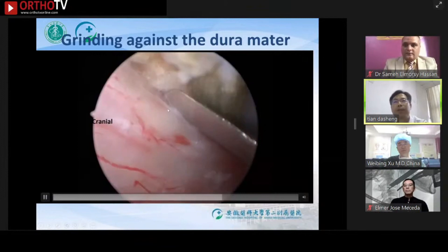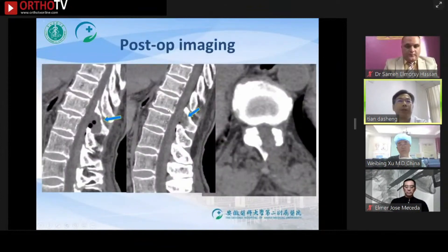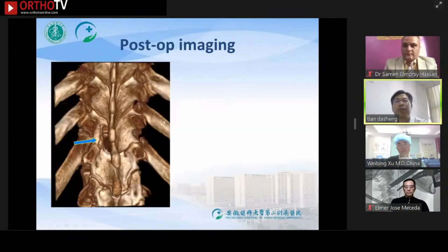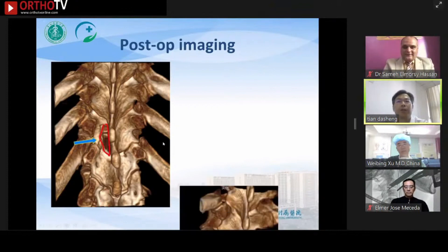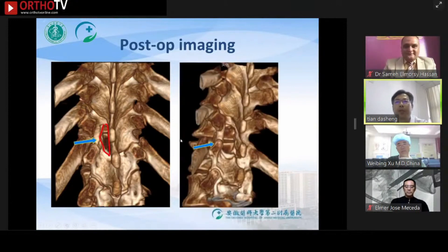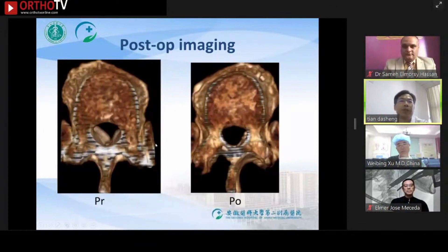We can see from the CT that the decompression of the bony spinal canal is complete. The three-dimensional CT shows the use of the laminar bone window resection technique, with the facet joints well protected. The three-dimensional CT also shows the complete ossification resection within the spinal canal.